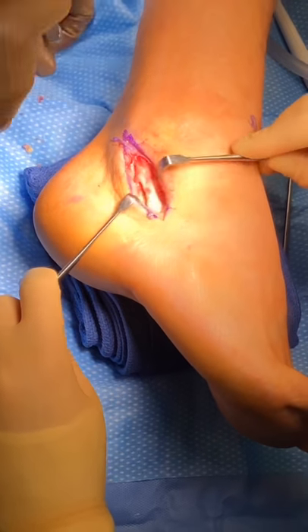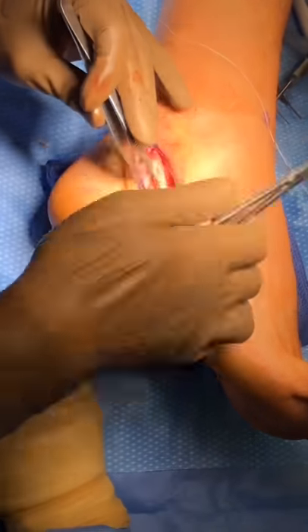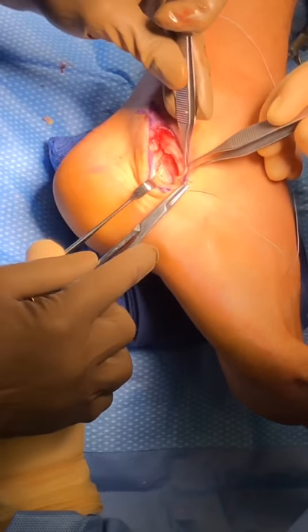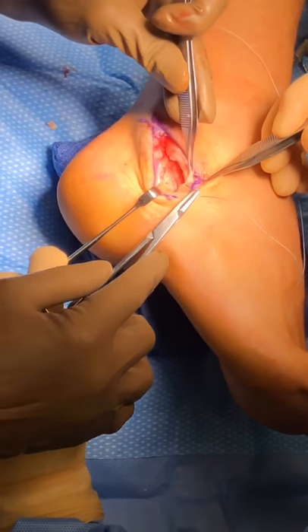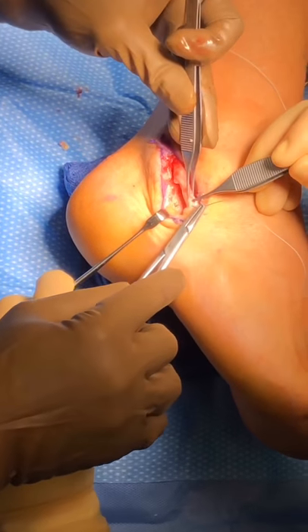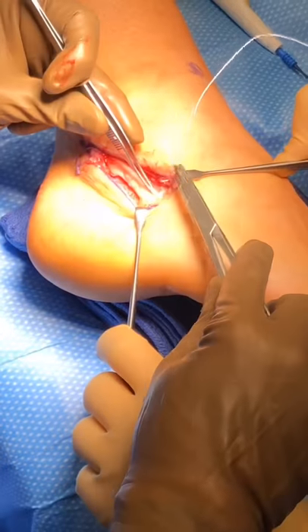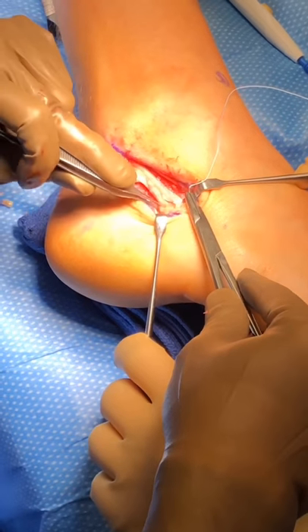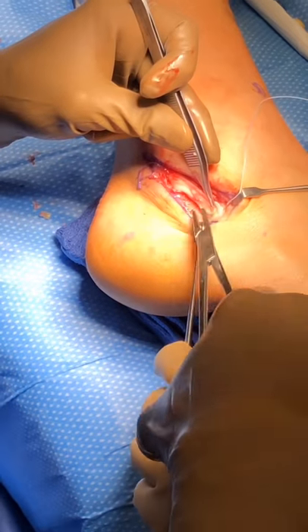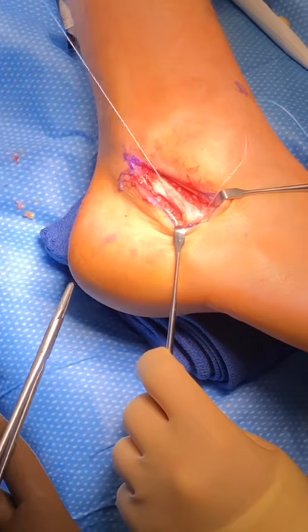Okay, you got the fiber. And so for these repairs of these tendons, we prefer to use a non-absorbable type suture. So typically for these repairs, we'll do a running stitch with a non-absorbable suture.